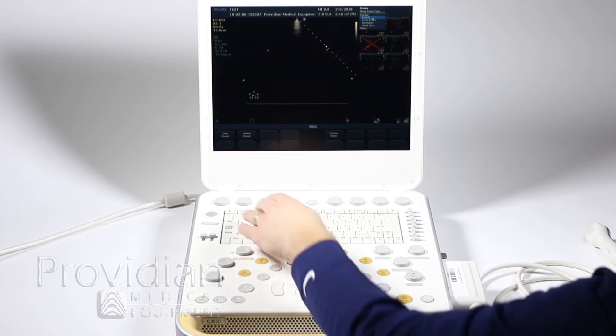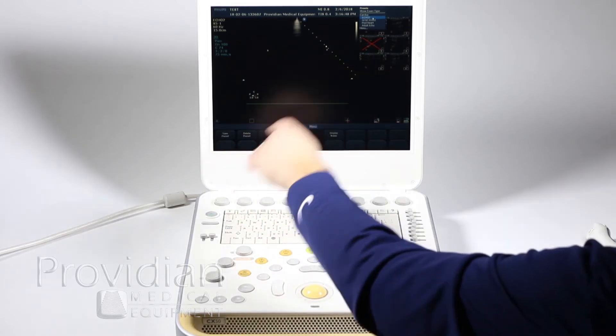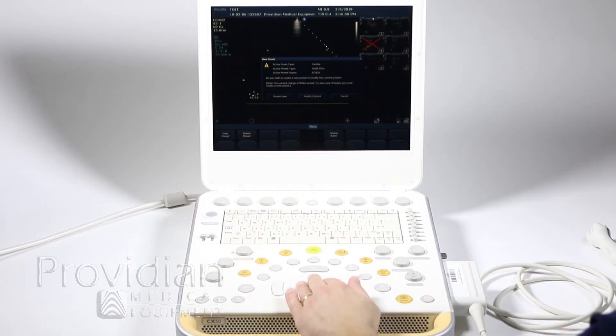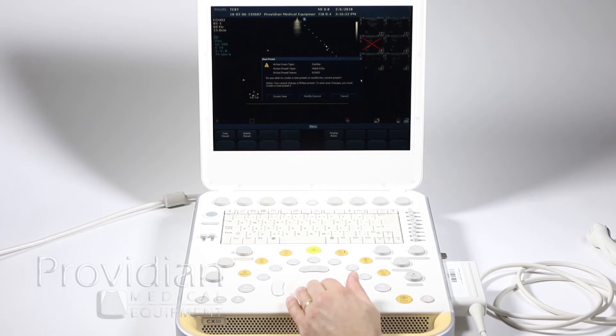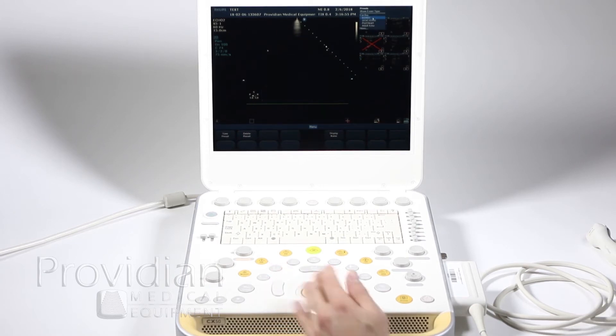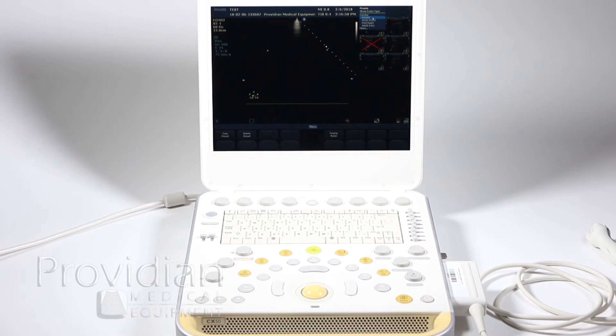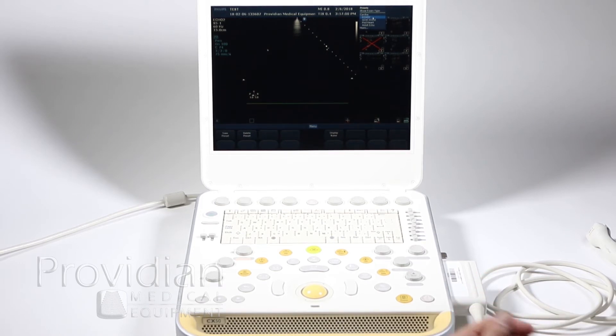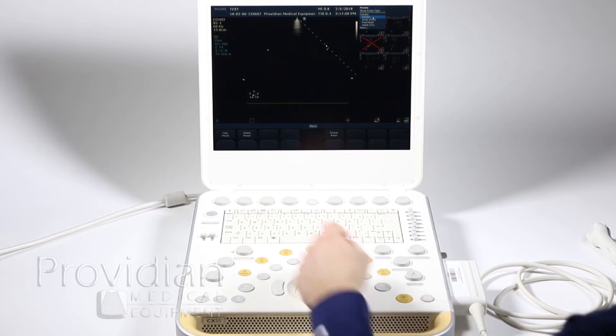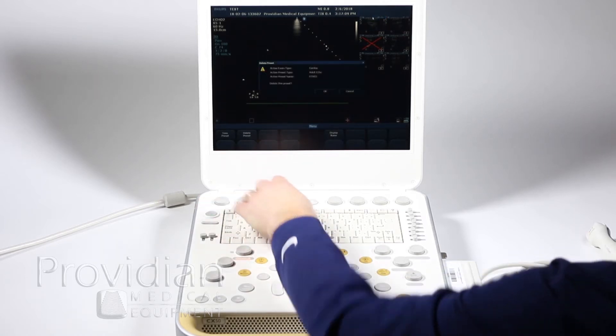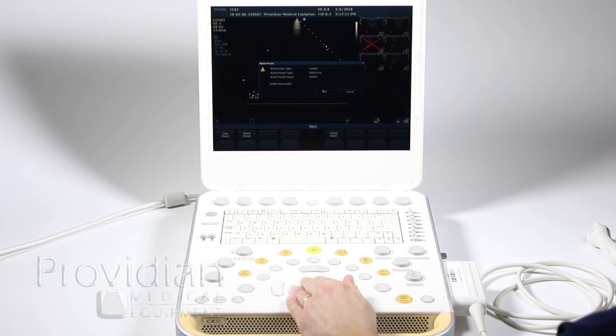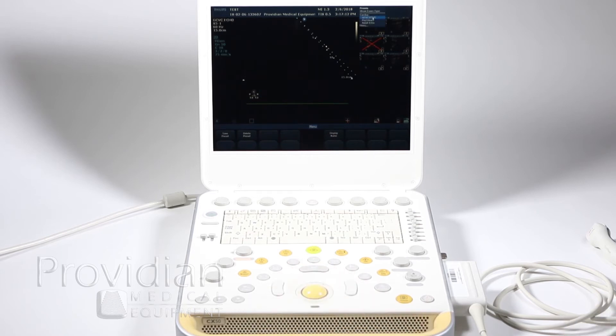I'm going to keep it right now. I'm going to hover over that and then hit save preset and do I want to modify the current or create new. That's basically if you had made changes and you like the frequency a little bit better this way or that, then you can modify your custom preset. So I'll just go ahead and delete that and click okay.